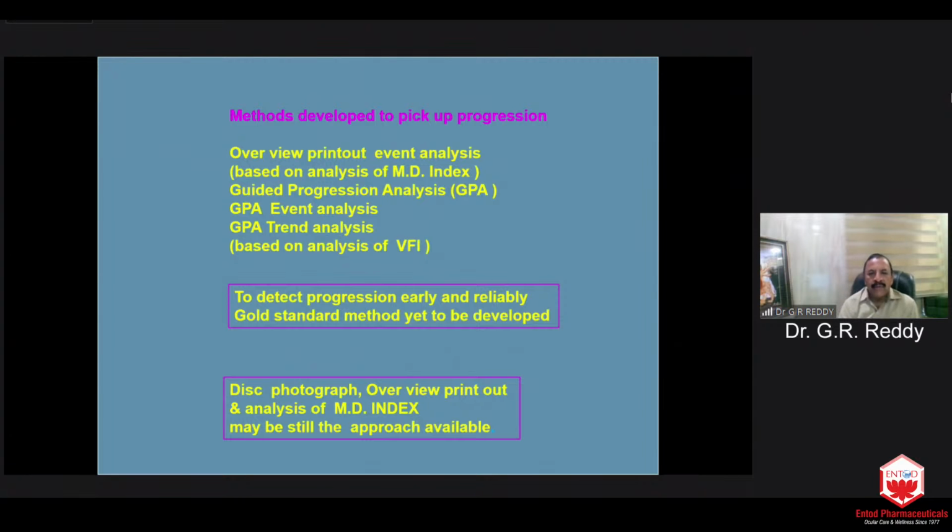And whenever you see whether this patient requires a 10-2 field also, you concentrate on the 16 points, you concentrate on the fundus examination. And mostly the glaucoma starting within 10 degrees, they will have 100% nerve fiber defect. Once you see a nerve fiber defect, you should always follow the nerve fiber defect from where it is coming. If it is coming from the fovea, we have to go for 10-2.